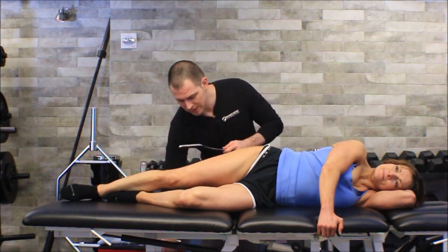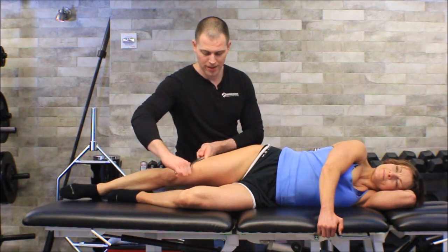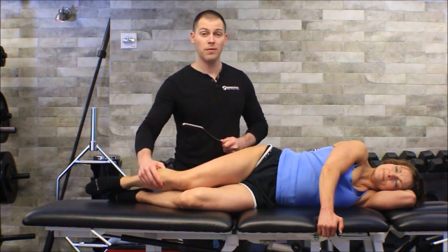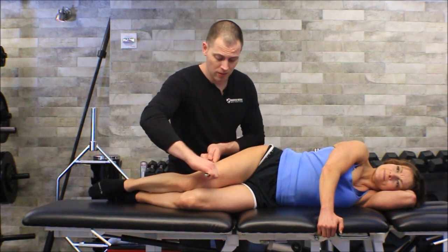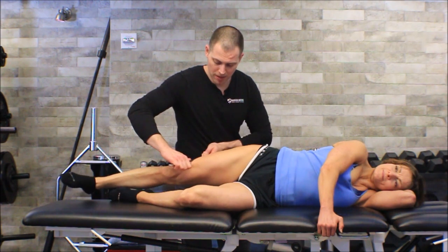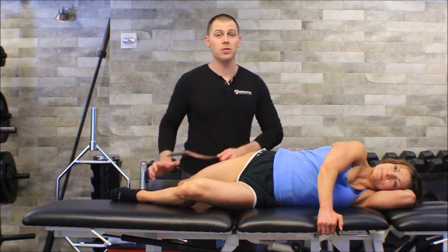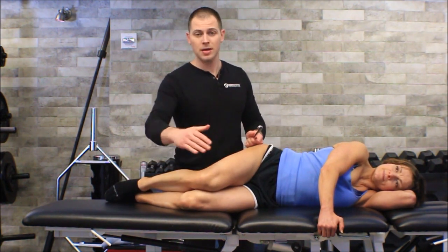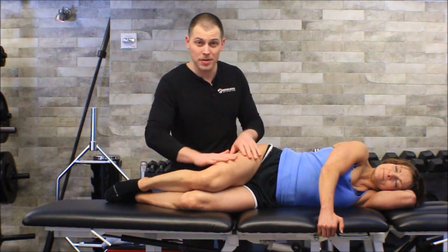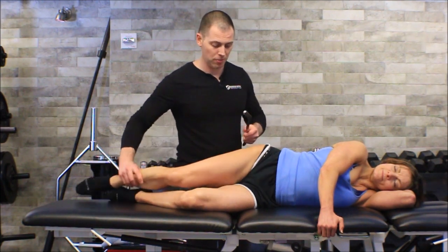Going into a little more extension so I don't have to follow quite so far. Hold there, go back into extension, fall off the table. If you want to experiment with some knee flexion or extension you absolutely could — so she can pull off that way, flex her knee, then go down. You can work with a couple different directions, trying to pin the tissue and then pull the muscle fibers and the different layers of fascia underneath that pinned tissue. Of course I could do that in a couple of areas.